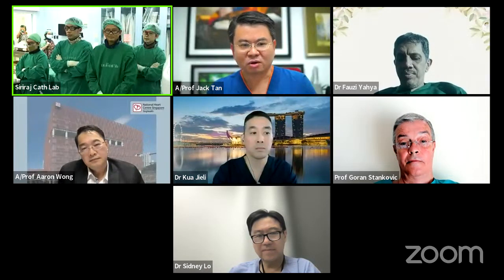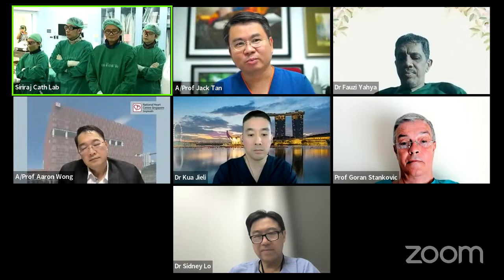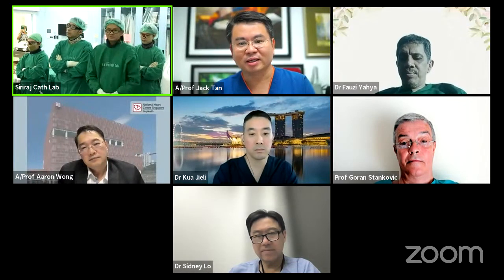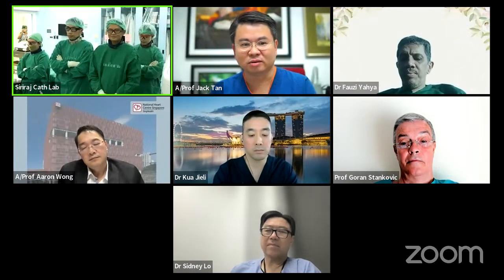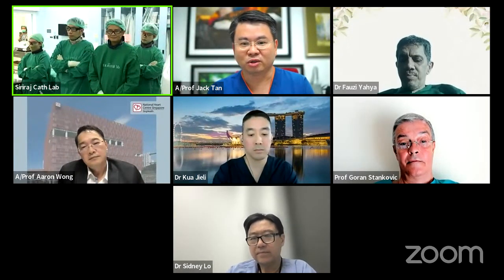So I think that's up for more evidence gathering. Goran presented very well the data supporting a provisional stepwise approach. I think in this case, with Medina 110, it was actually perfectly demonstrated that the provisional approach worked extremely well.